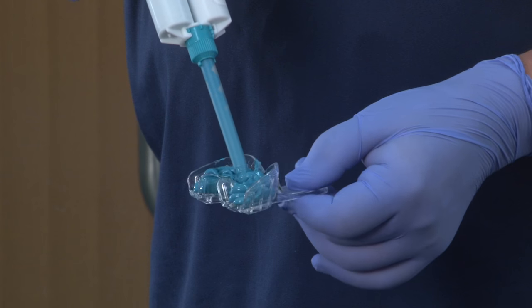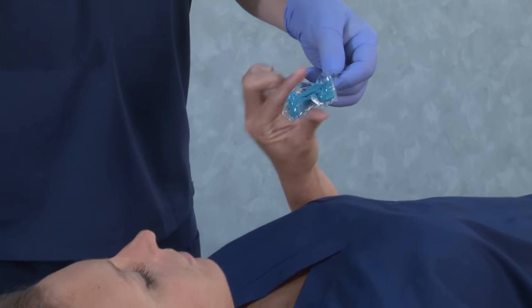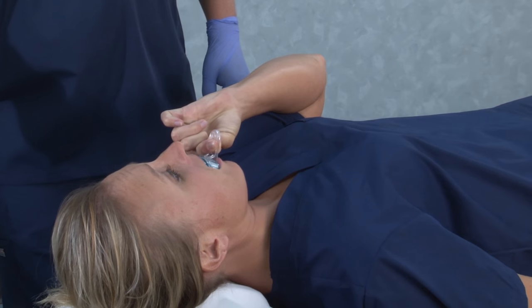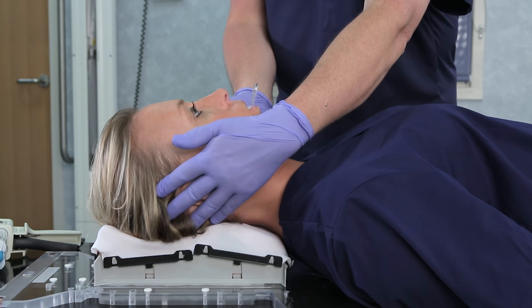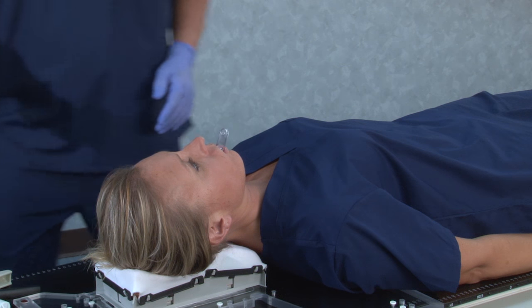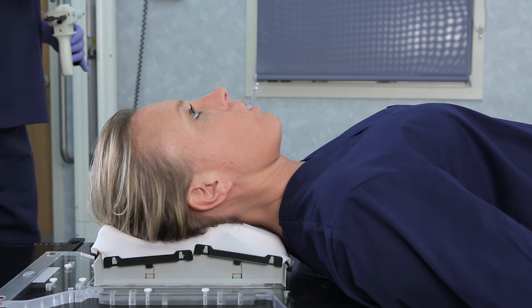Fill the bite tray with putty. With the patient lying down, insert the bite tray into the patient's mouth. Make sure the top lip is completely over the bite tray to ensure a complete impression of the teeth and/or gums. The jaw can remain relaxed. The putty can be recapped for reuse. The bite tray should remain in the patient's mouth for two to three minutes or until the putty is set.